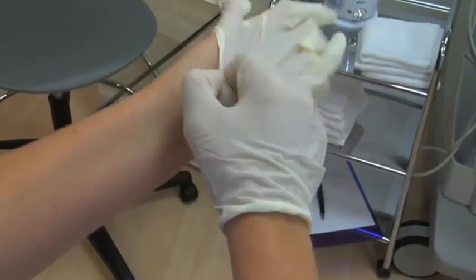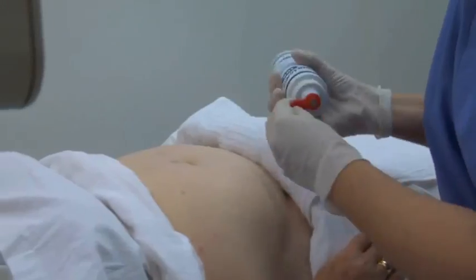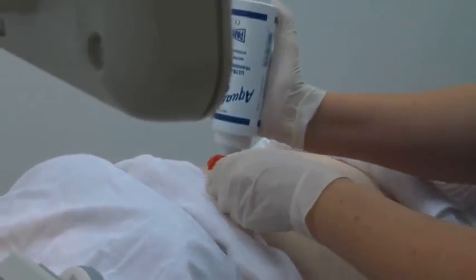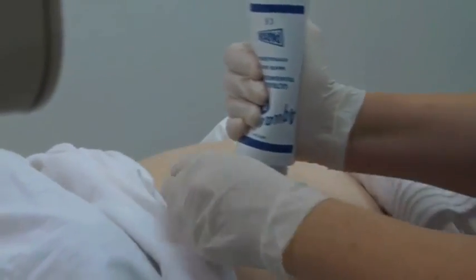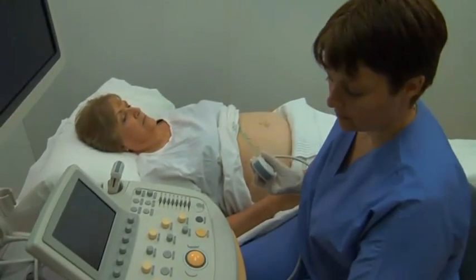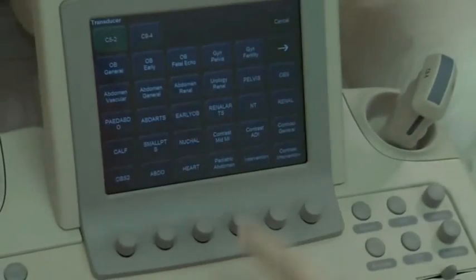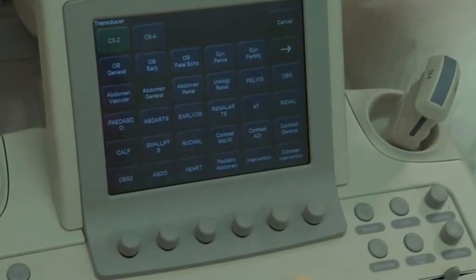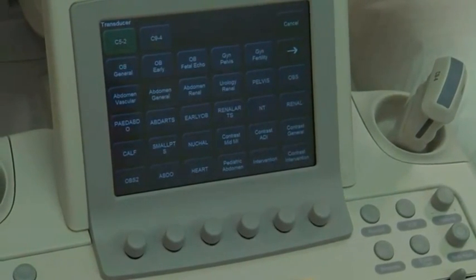Put on gloves. Expose the patient's abdomen and apply acoustic gel to the right lower costal margin. Select a transducer of appropriate frequency for the scan and select the appropriate transducer setting. Confirm the correct transducer selection and preset on the ultrasound machine.